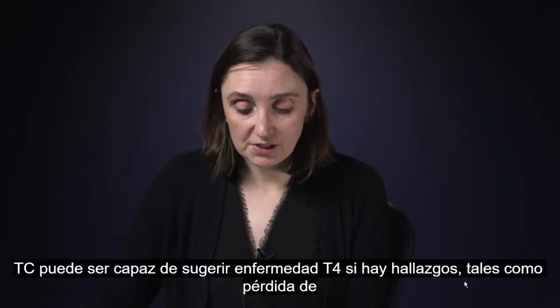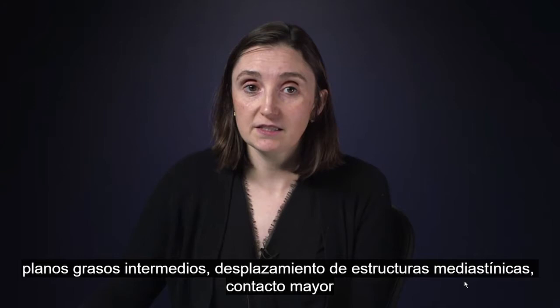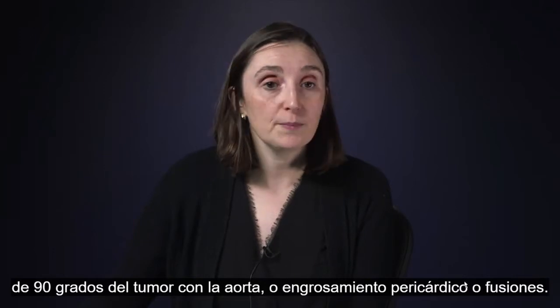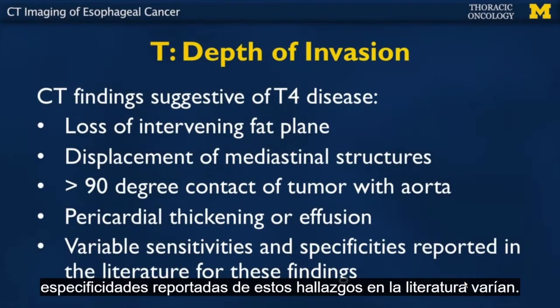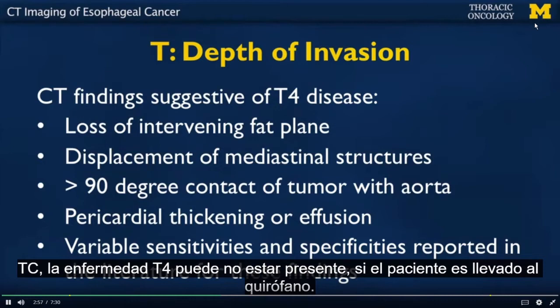CT may be able to suggest T4 disease if findings such as loss of intervening fat planes, displacement of mediastinal structures, greater than 90-degree contact of the tumor with aorta, or pericardial thickening or effusions are present. However, the reported sensitivities and specificities of these findings in the literature varies. Therefore, even if intervening fat planes are lost on CT, T4 disease may not be present if the patient is taken to the operating room.